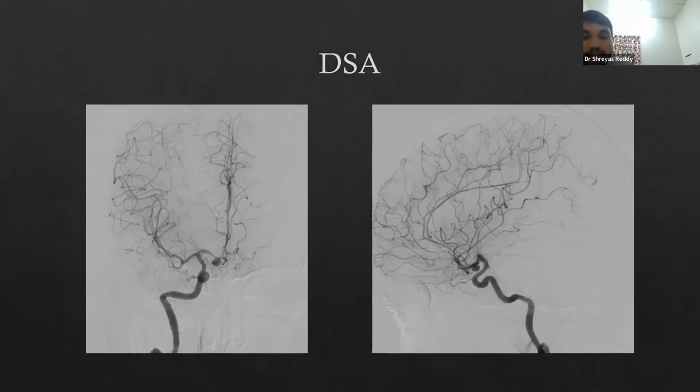Vasospasm. Yeah, the patient's arteries are in severe vasospasm. This also determines the patient's GCS. The patient's GCS was actually dropping. So when we took up the patient, we had to infuse milrinone and nimodipine. Okay, so this is cerebral vasospasm in a case of ruptured ACOM aneurysm.